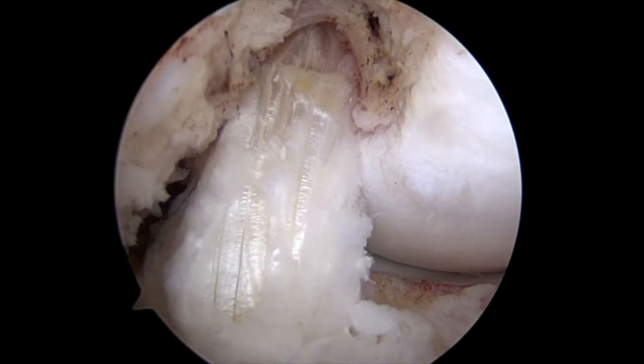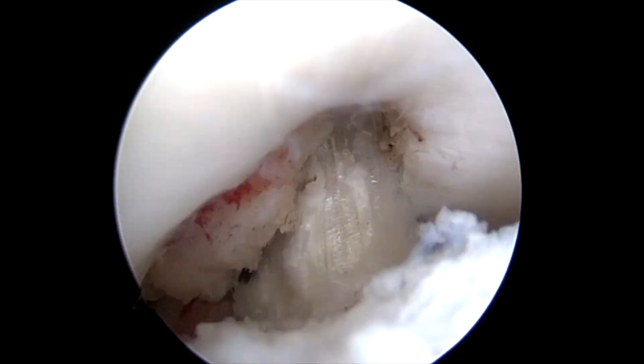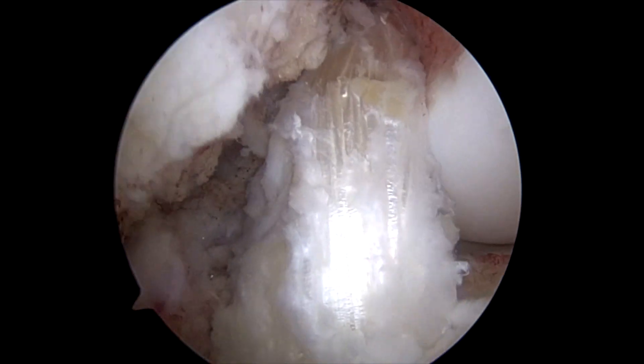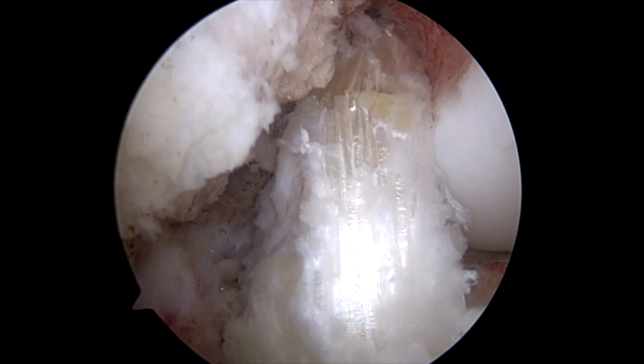Her previous ACL reconstruction wasn't stable, so here's the reconstruction I performed. This is necessary because without a stable ACL you're at high risk of tearing your medial meniscus — which is exactly what happened in this case.